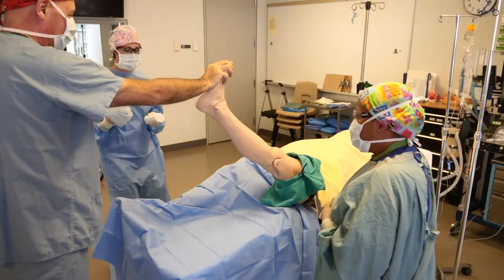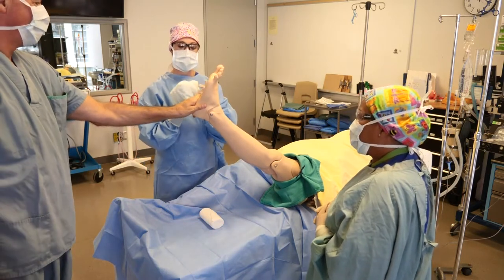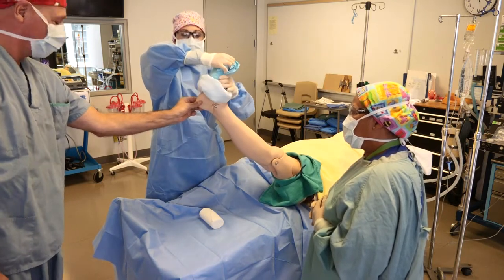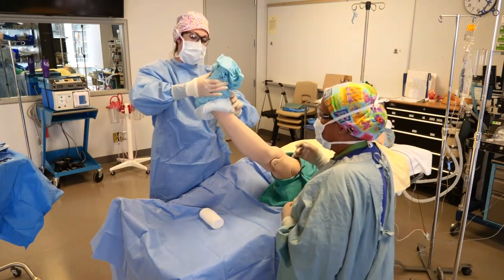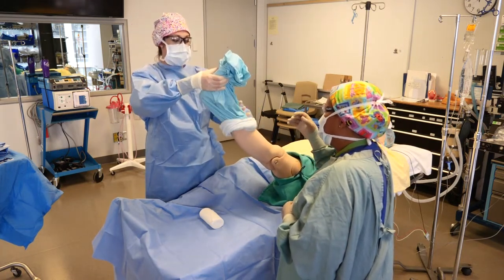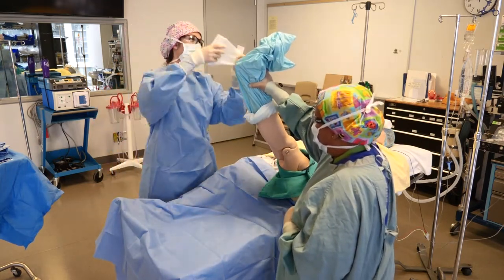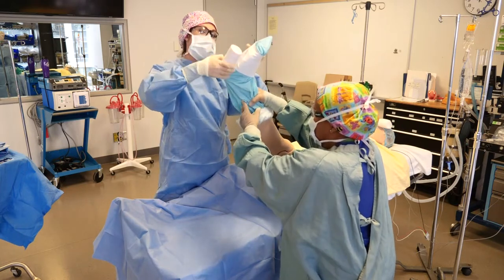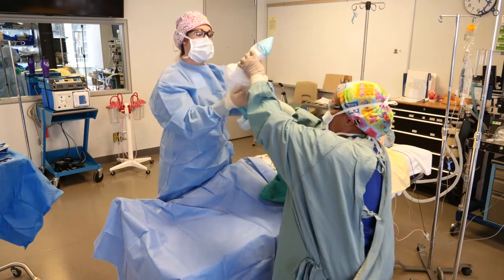Now we're going to use a foot bag and a 6-inch flannel to cover the patient's foot, which is often unprepped. Here we have a stockinette bag which is unraveled over the patient's left foot. The resident signals the circulating nurse to remove her hand. We have the scrub nurse who will then support the leg. The resident then wraps the stockinette bag with the flannel, starting from the toe and moving down towards the patient's knee.